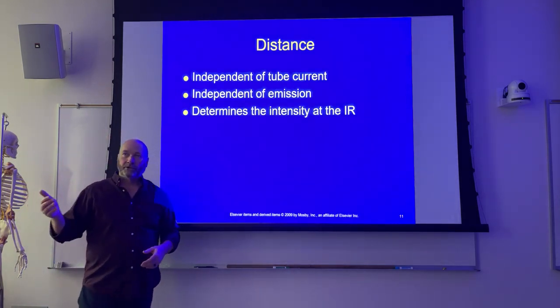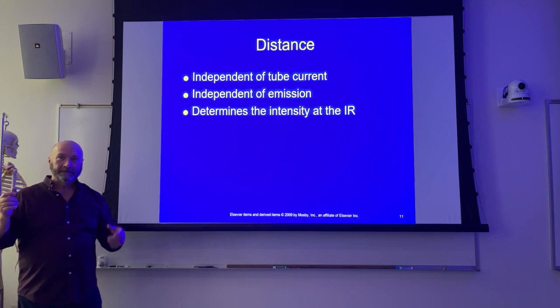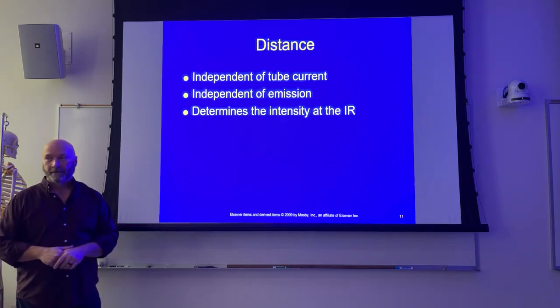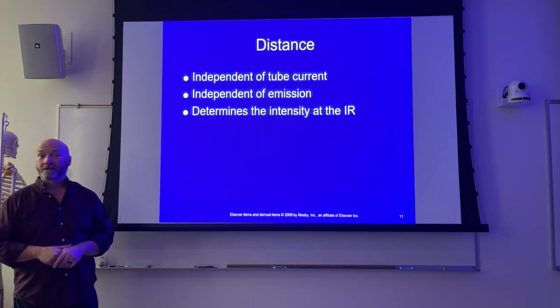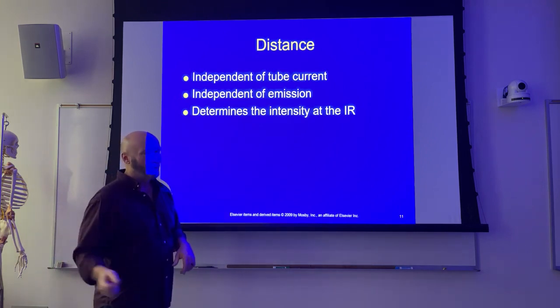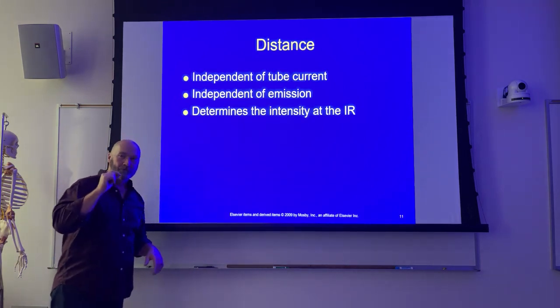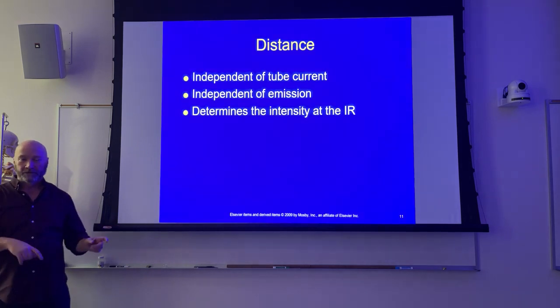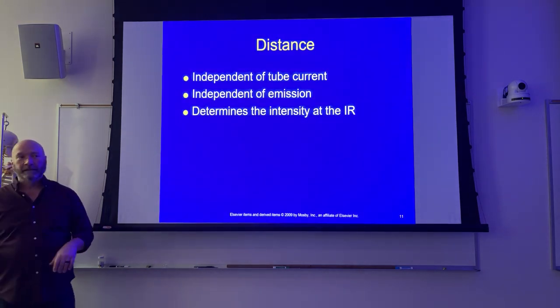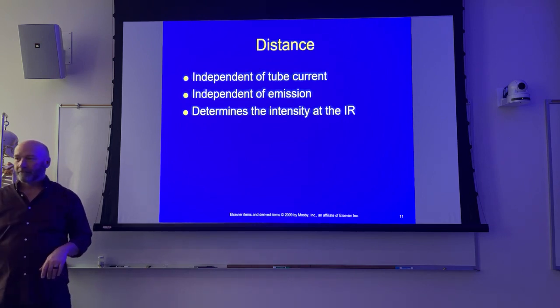What is your cheat for changes from 40 to 72 inches? I don't remember. 3.24, right? So if you shoot the perfect X-ray at 40 inches, you go back to 72 inches, you're going to have to increase your mAs by a factor of 3.24.